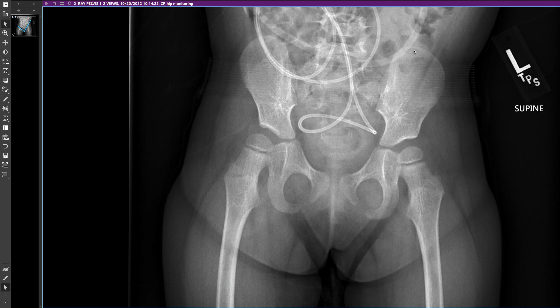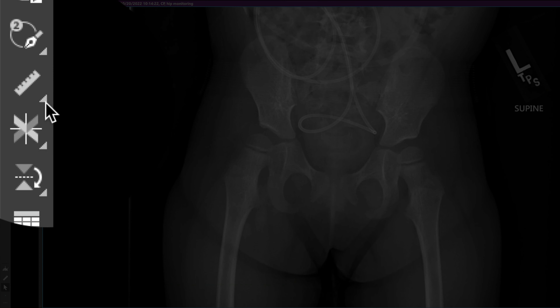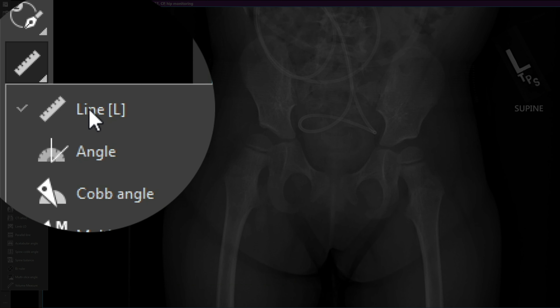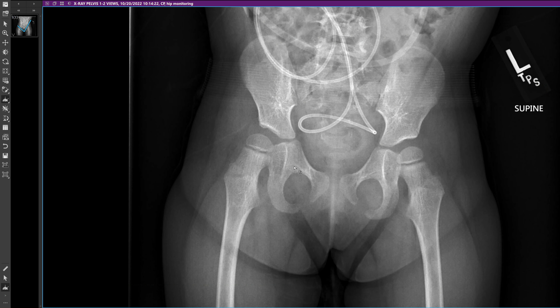I'd also love it if there was no rotation such that the iliac crests were at the same level, but that is something that we can correct for pretty easily. In essence, we're looking at the amount of femoral head that lies outside a vertical line drawn from the lateral edge of the acetabular tectum on both sides. The best way to start is to click on the little triangle on the left-hand side and choose the angle measurement tool, because we do have to correct for that slight rotation.